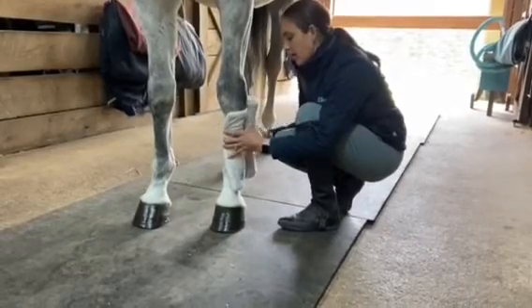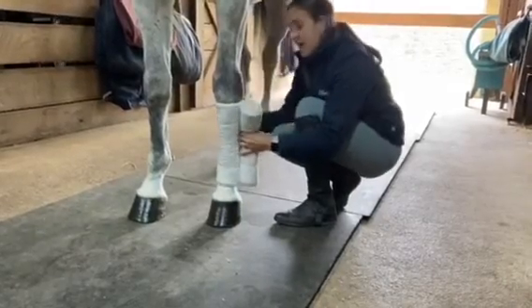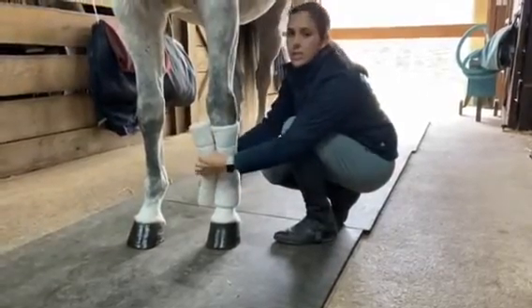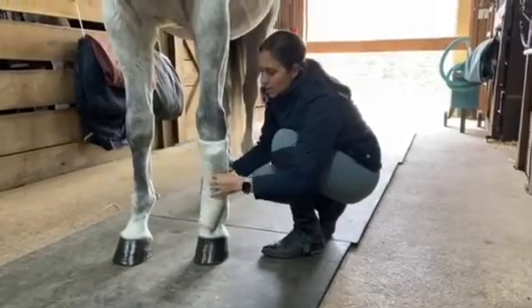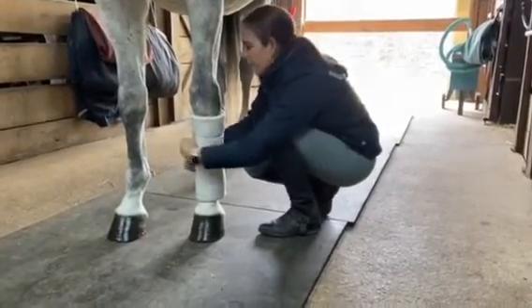We're going to roll around the horse's leg from front to back and from the inside to the outside of his leg. As you come across the front of the bandage, you give a little tug and then just roll around the back of the horse's leg so that you're not pulling across the tendons and ligaments. A little tug across the front, keeping it close to his leg so it doesn't come loose around the back.